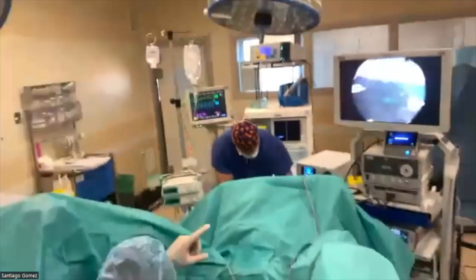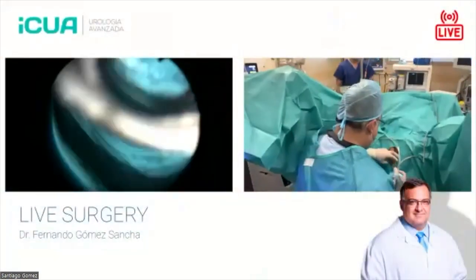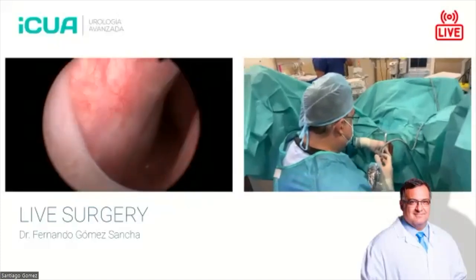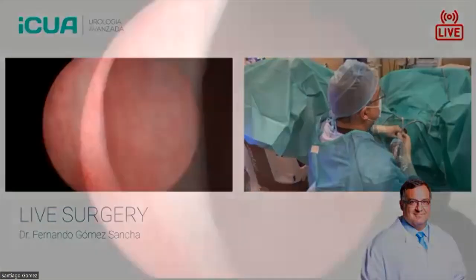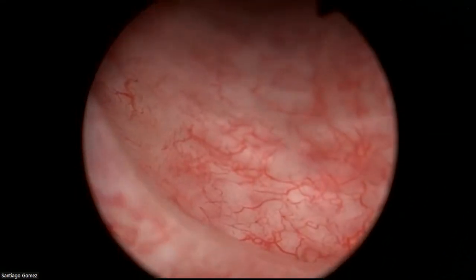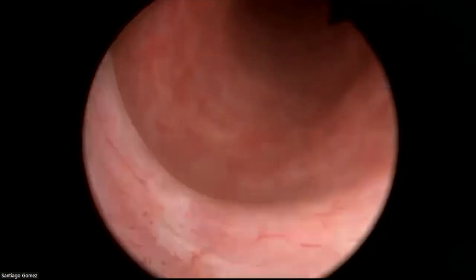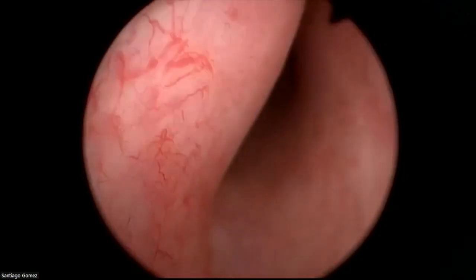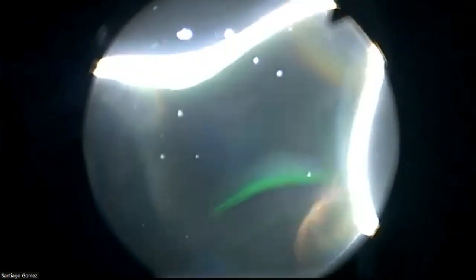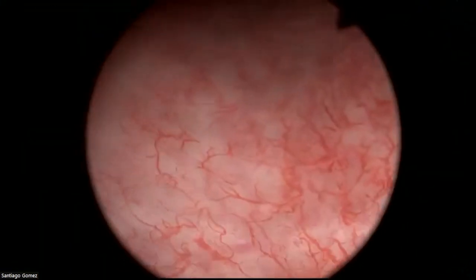Okay, so we will change to the endoscopic image, Santi, because we're going to start and have a look inside. Okay, see what's going on in here. The initial part of the urethra is a little bit resistant to the scope, so I will. Let's put some more gel. It looks a good caliber, but for some reason I'm having trouble to enter. And I don't want to force, of course.